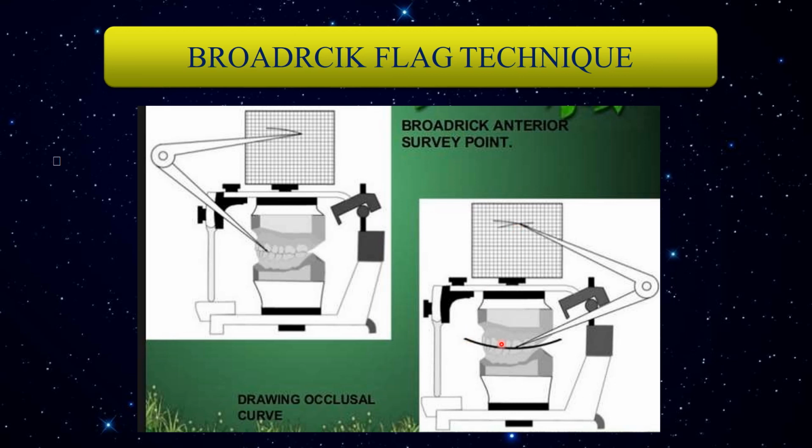Then using a carbon marker in the compass, you mark a line on the opposing dentition, using this center as the center of the arc and the fixed width of the compass that we used before. Any teeth that are above or below this line, that is natural teeth, are then ground. The enamelplasty is done first on the cast and then in the patient.